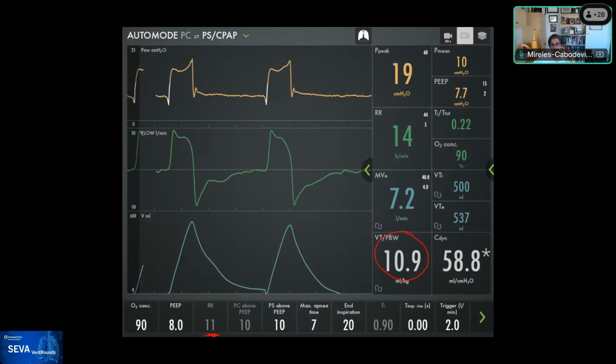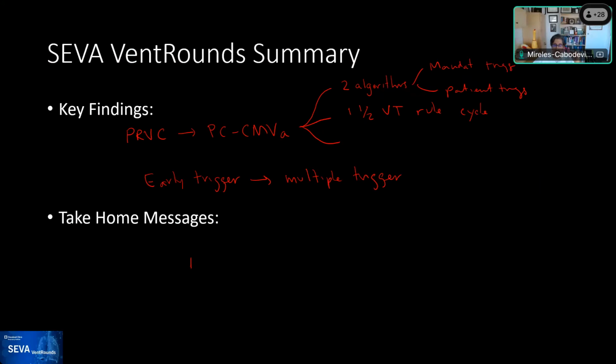And then we changed to pressure support, and we saw that we couldn't keep our safety goal. And we said, that's it, paralysis for this patient, because the patient was already sedated. And even though the patient was deeply sedated, we were unable to do any changes on the ventilator to maintain safe ventilation. And so the goal rules your actions.